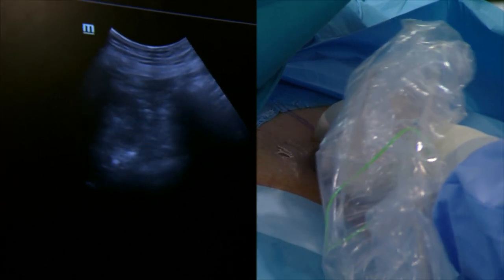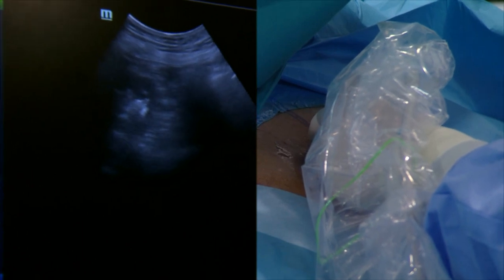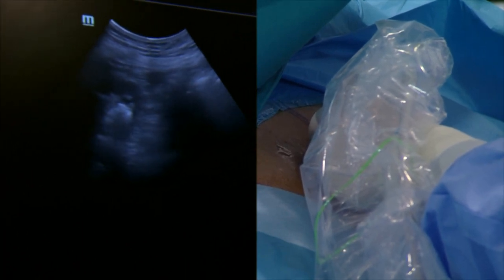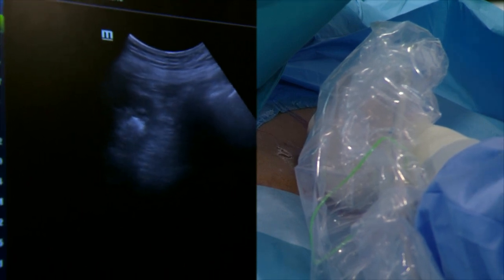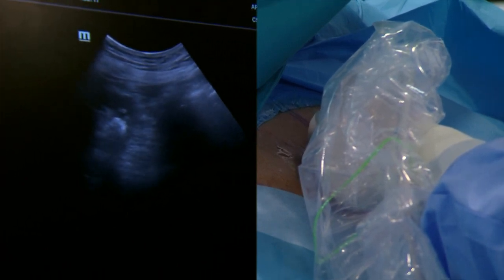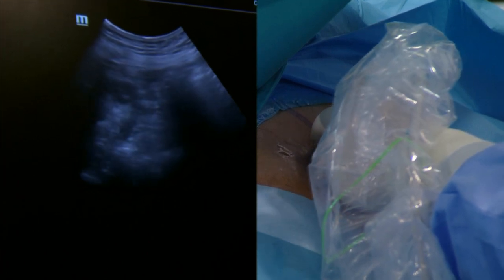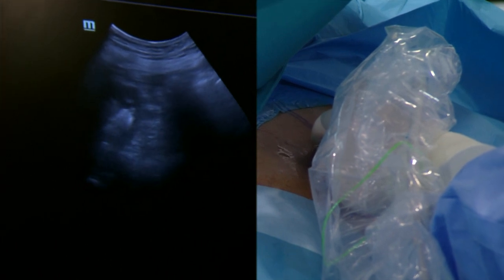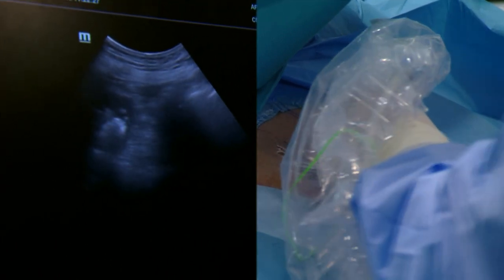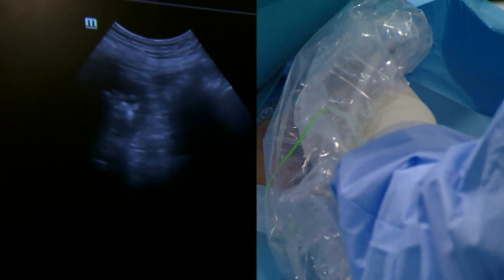That's why we called you. We are next to the lower calyx. Yes, we see the needle clearly. Not yet. The needle is pushing the kidney, no? It's really very difficult. Another knife, please.